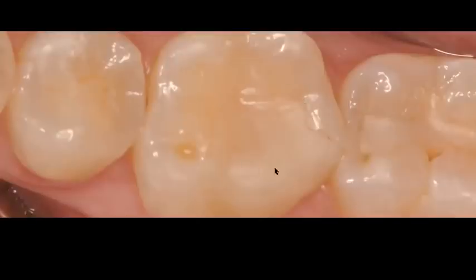The other thing that I want to mention here is the occlusal analysis. When you have large restorations like this, yes, you want to make sure that you do your successive cusp buildup technique. You may want to combine it with a centripetal technique. That is another concept that I'm going to share with you today. But the most important thing is that you have to ask yourself, where are the occlusal contacts? Where are the occlusal contacts on this particular tooth?